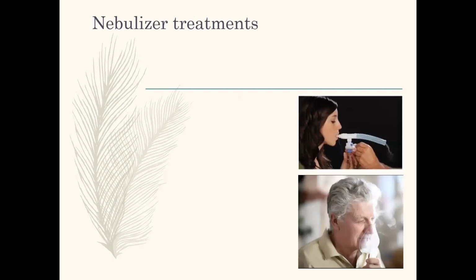Nebulizer treatments. Most of our clients that are in the hospital are probably going to be switched over from some type of inhaler to a nebulizer treatment. Now, with COVID, they tend to stay more towards inhalers, but with everything else, they tend to go more towards nebulizer treatments. Clients can have nebulizer machines at home. So if they suffer from asthma or COPD, and they need to go home on some of these medications that help with oxygenation, there are portable nebulizer machines that they can utilize at home.